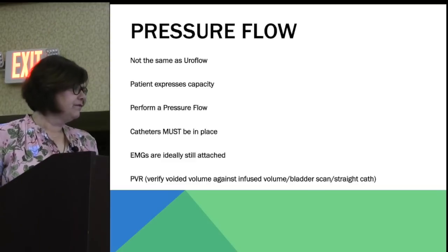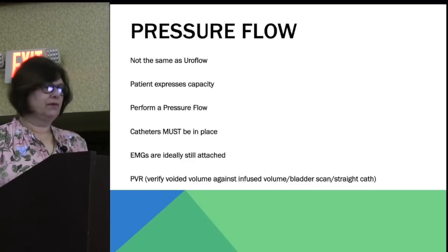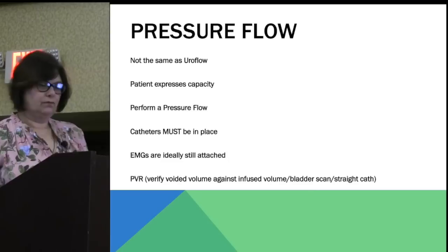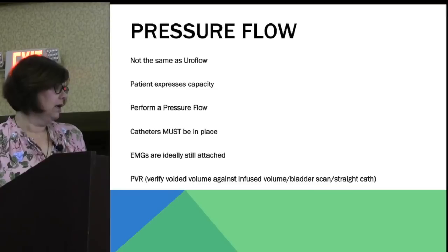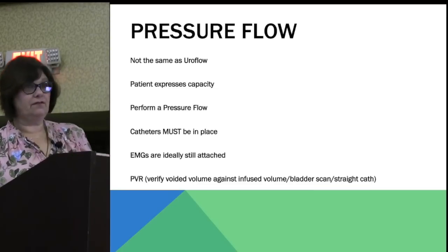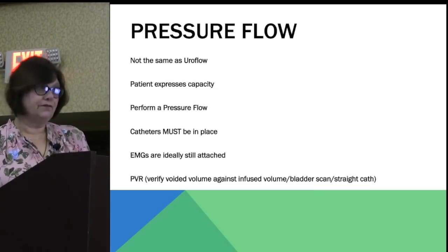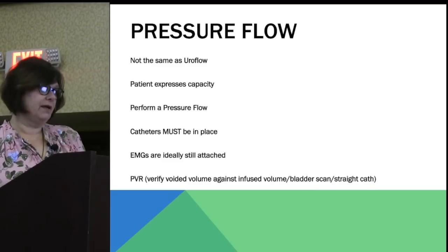And this is just about pressure flow. Again, it's not the same as a uroflow. The uroflow is what we did at the beginning without any catheters in place. We do the pressure flow when the patient says, I'm really full, and the catheters must be in place. If the catheters fall out before you do the pressure flow, it's not a pressure flow. And if you really need to get that pressure flow, which you should, put the catheters back in.